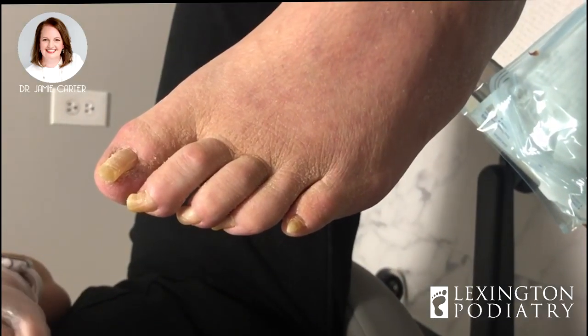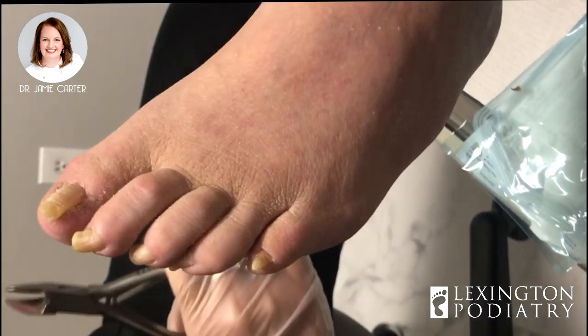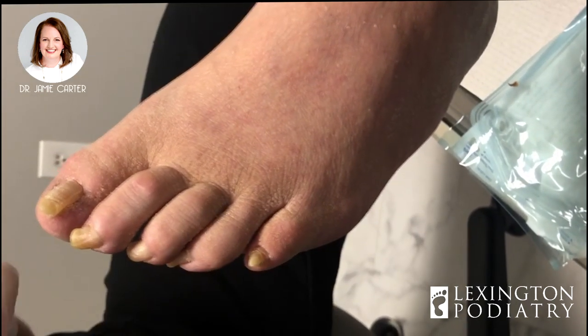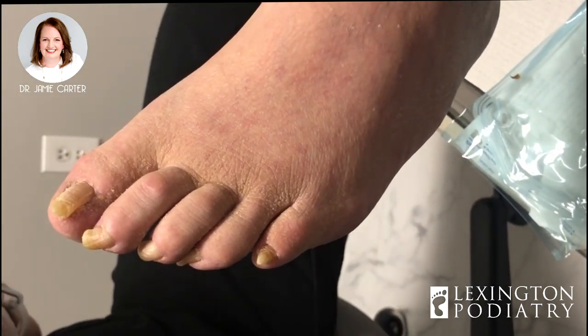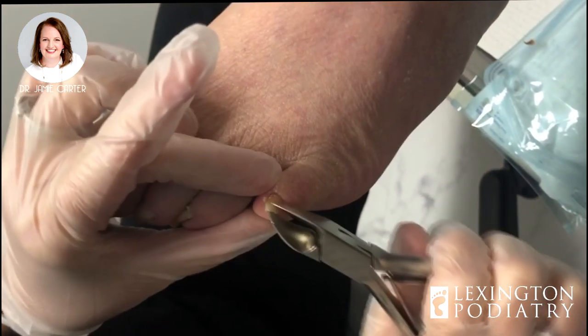Today this young gentleman is here for a toenail trim — these haven't been touched in a while. He did attempt the right foot but had an issue where he almost cut the tip of his toe off, so he decided that podiatric care was his best option.